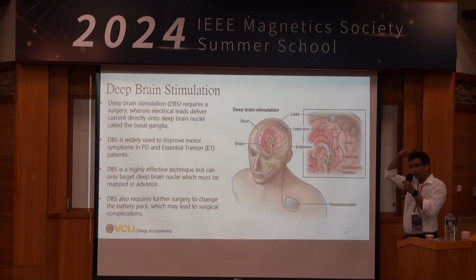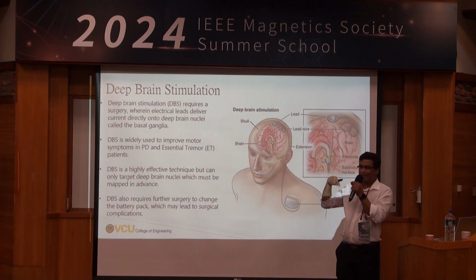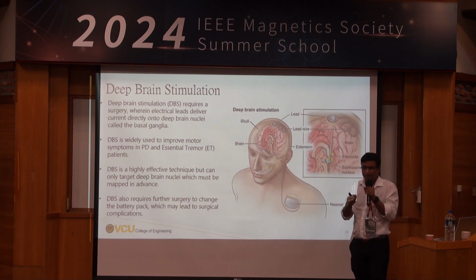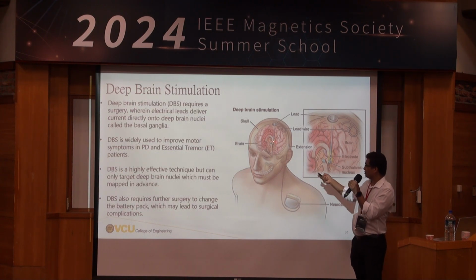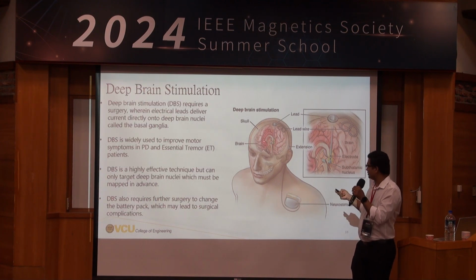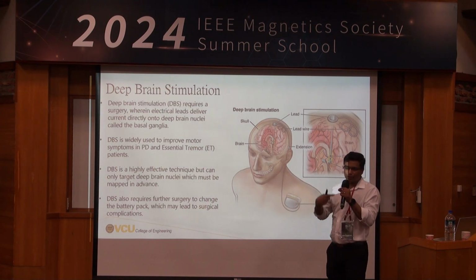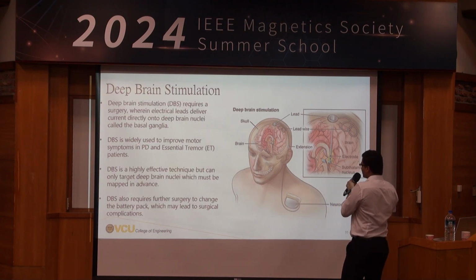Basically, there are 2 electrodes on both the sides. They are inserted, and the tip of the electrode stays at an area called subthalamic nucleus, STN. That's where the dopaminergic neurons are there. So when the dopaminergic neurons die, there is low dopamine, and low dopamine in that area causes the motor pathway network to go imbalance, and that's what gives you tremor in a Parkinson's patient.